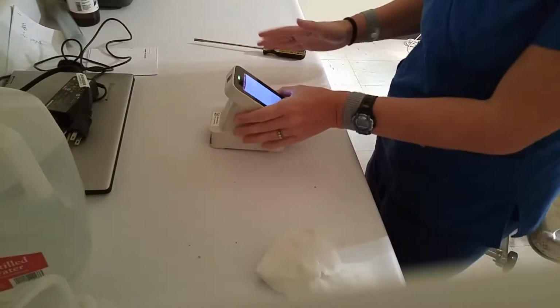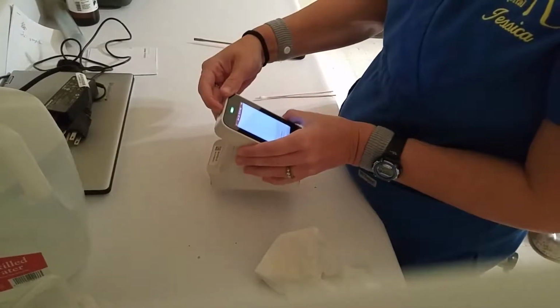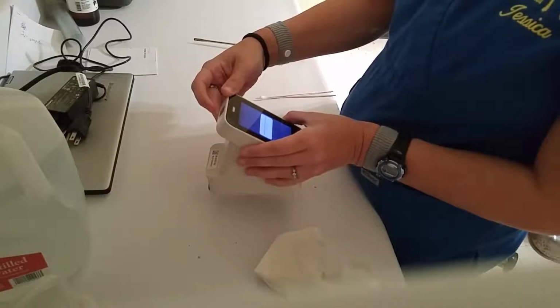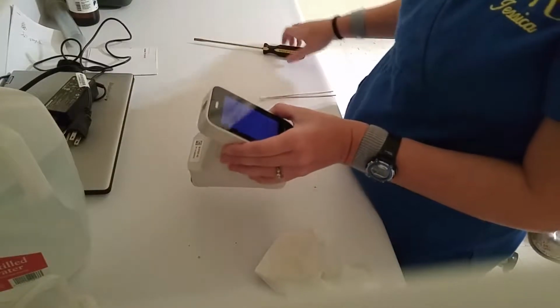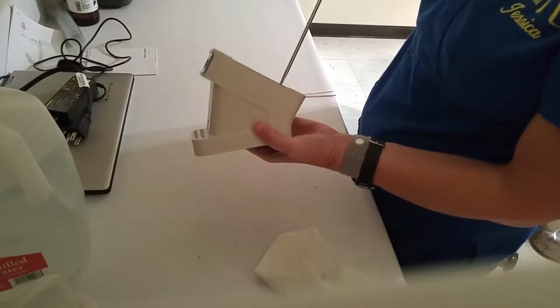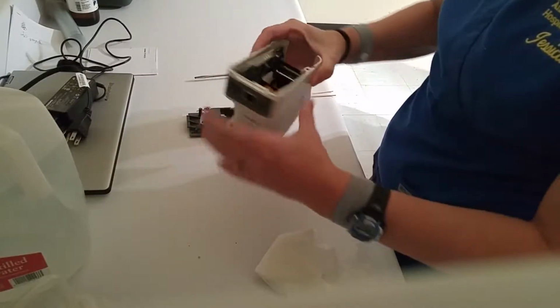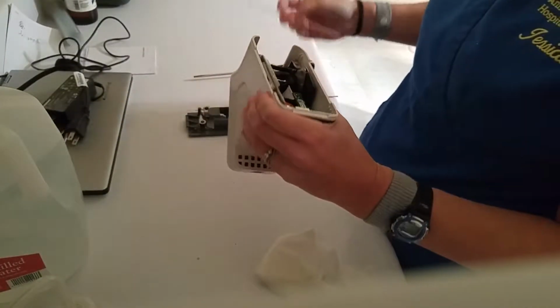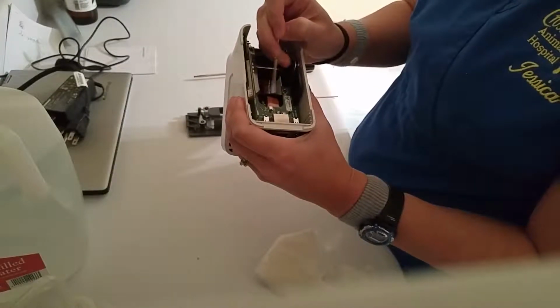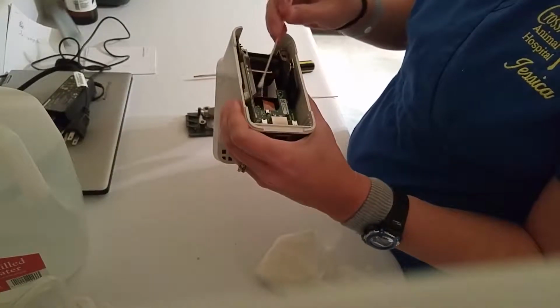I'm going to demonstrate how to do some maintenance on the Snap Pro. We're going to go ahead and turn it off. We've got it unplugged. Turn it over and unlock the bottom part here. Lift it up. Basically what we're going to do is check back here. I'm going to make sure that all this area is clean of blood. As you can see, there's some blood kind of caked up there from when the test snapped.